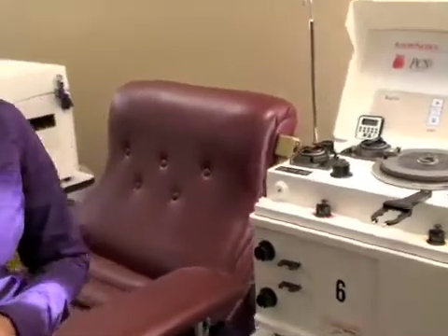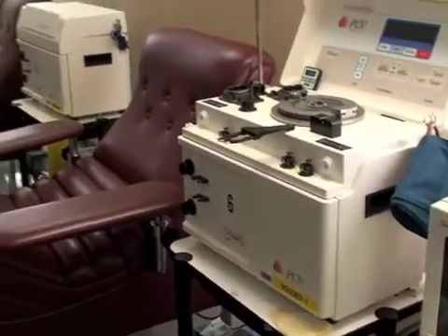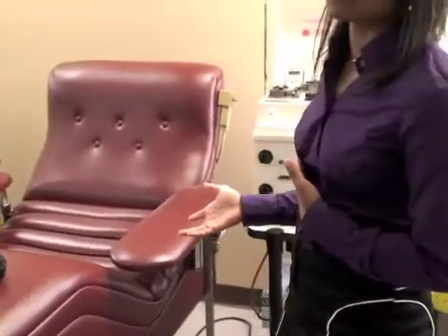So you can come in and give a whole blood donation, and we could potentially split your blood 3 ways, or you can come in and give plasma and platelets through a process called apheresis donation. And the process for the donor is very similar to a whole blood donation, except it takes longer. So plasma, you can be in the chair for 35 to 45 minutes. And for platelets, it can be 75 to 100 minutes. And that's why you'll notice when you come in to donate that certain donors are in much more comfortable chairs with their own TV screens, and that's because they're here for longer.